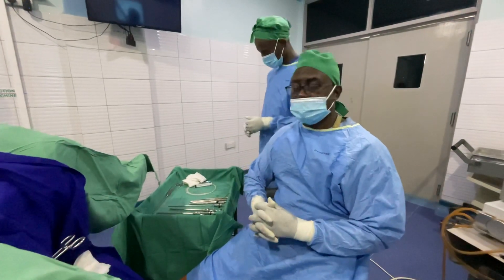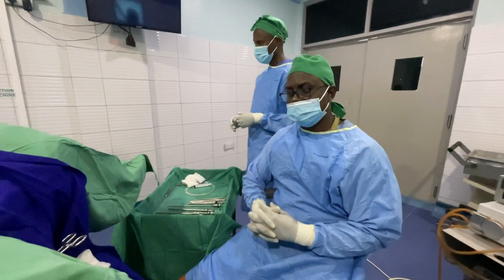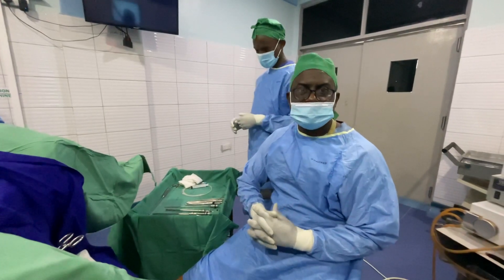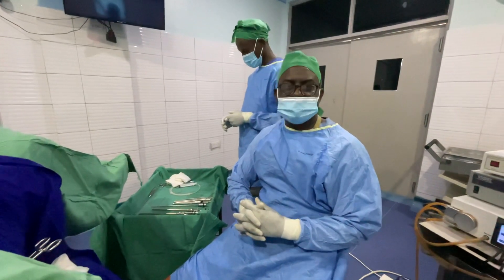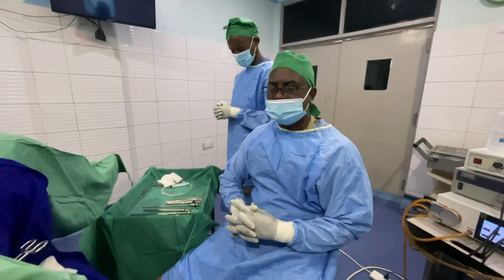We are going to do a hysteroscopy on this patient because we are doing a diagnostic survey for the case of infertility.